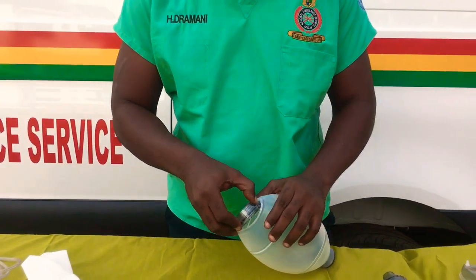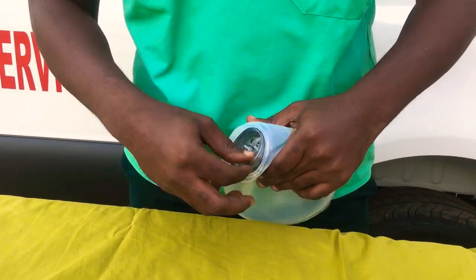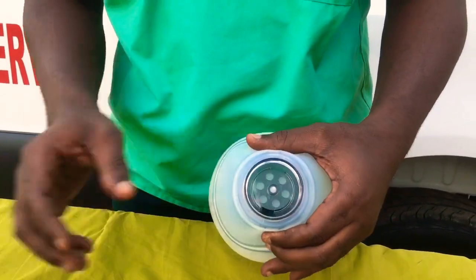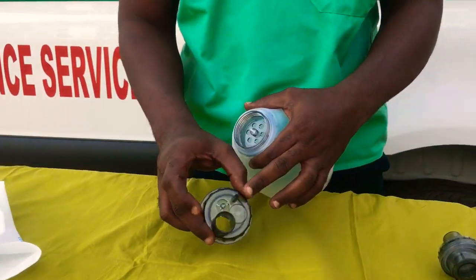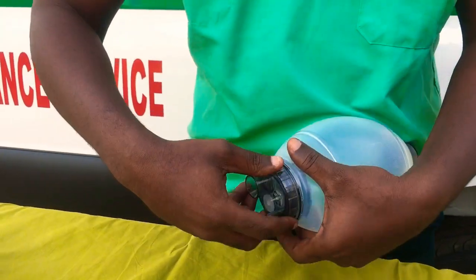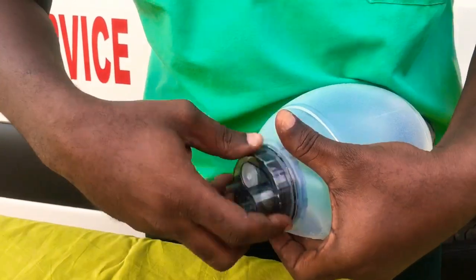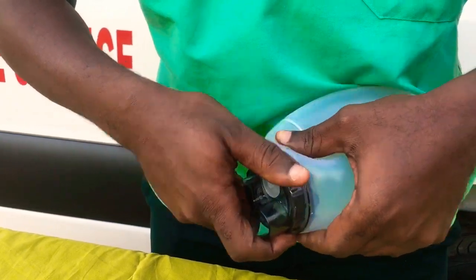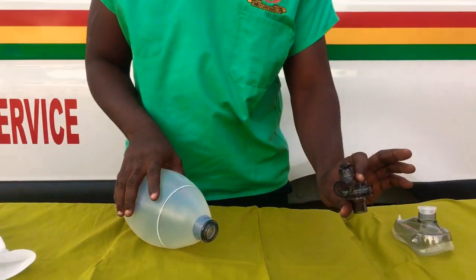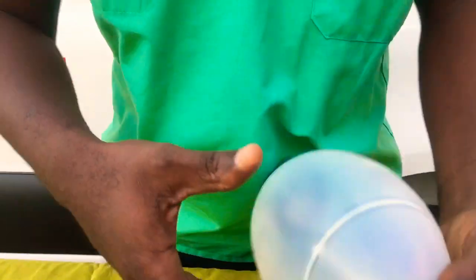So let's see how to assemble the various parts into one unit. First, you pick this and then you put it inside this way. Make sure you get it this way, hold it this way, and then you tie it. Make sure you tie it firm. Then you take the pressure gauge regulator and you fix it into its port here.